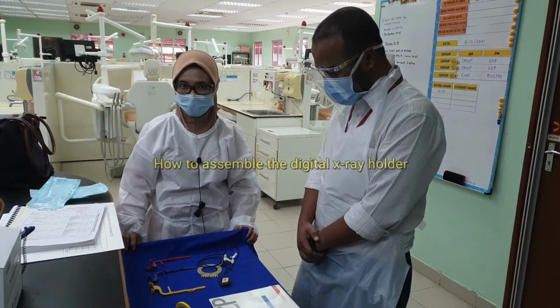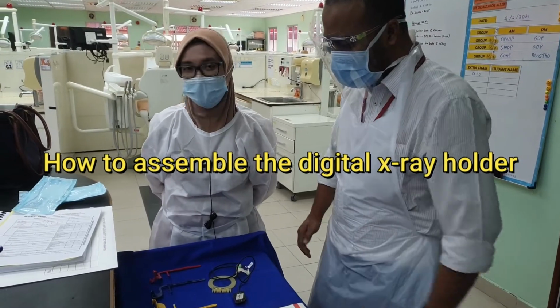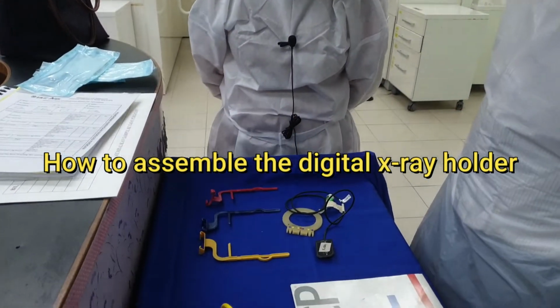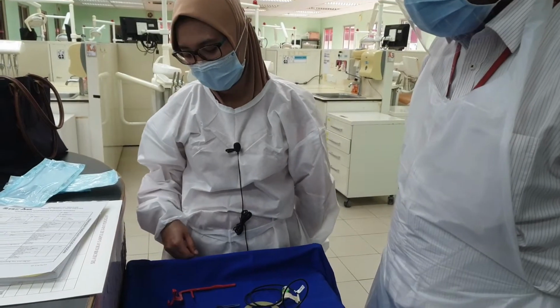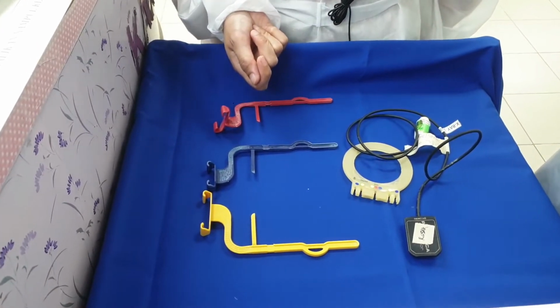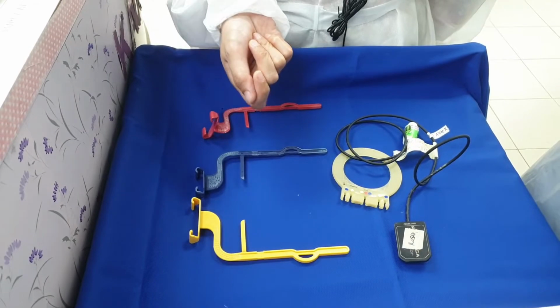Next, we will show you how to assemble the digital X-ray holder. The color coding is still the same as the manual one. Let me just recap. The red one is for Bitewing. The blue one is for periapical anterior. The yellow one is for periapical posterior.